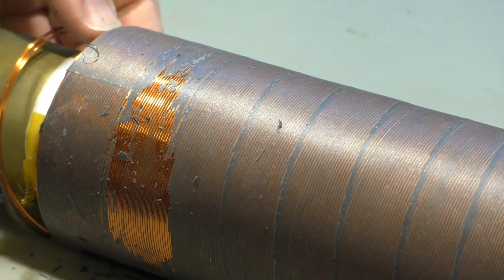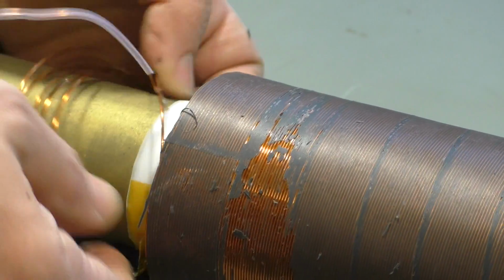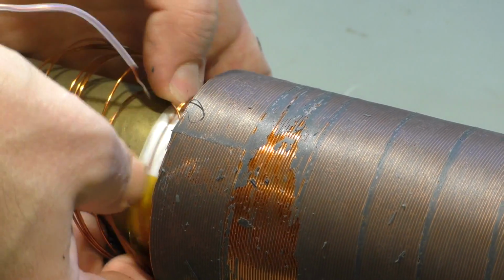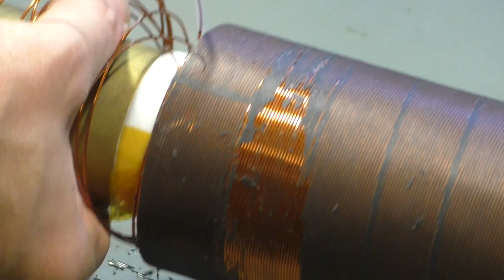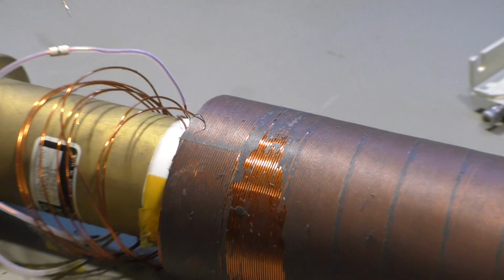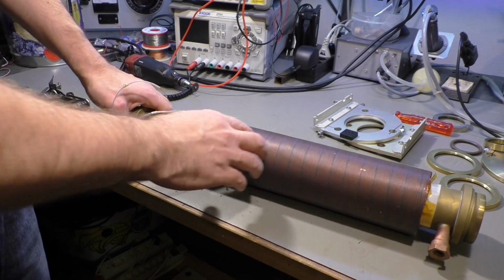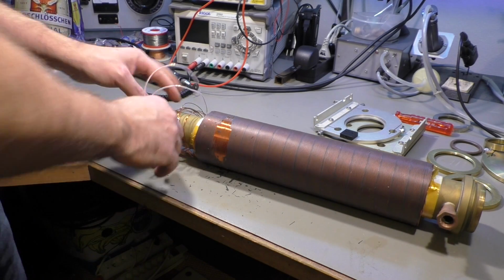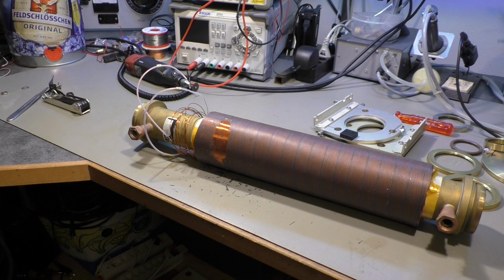Yeah, well, the winding is falling apart, so it's not impossible to remove that copper, which is quite a lot. And also the brass tube is relatively massive, so I think I have something for the copper recycling that gives a few bucks back if we sell that. Okay, that's about the tube. Let's see what else we have from that Coherent medical laser system.